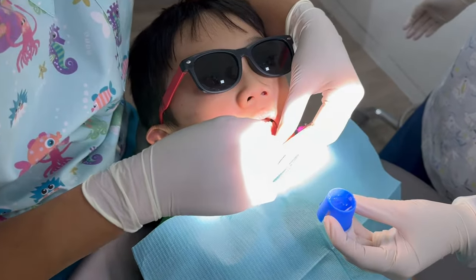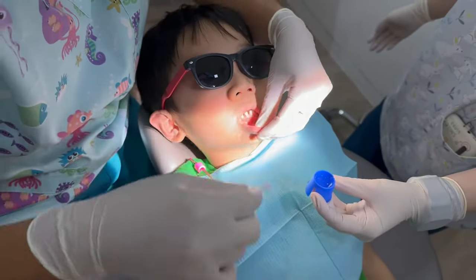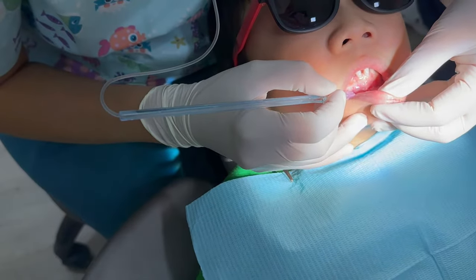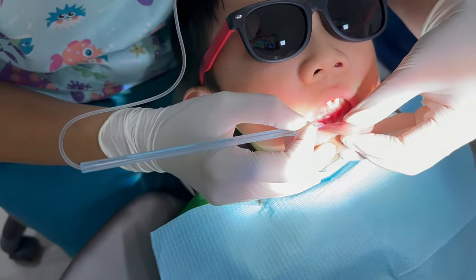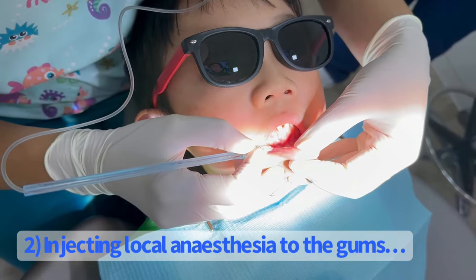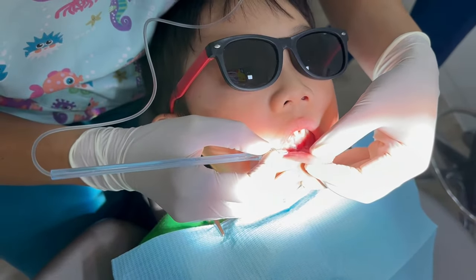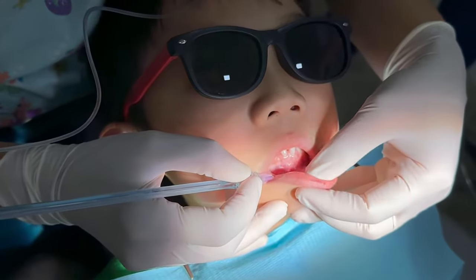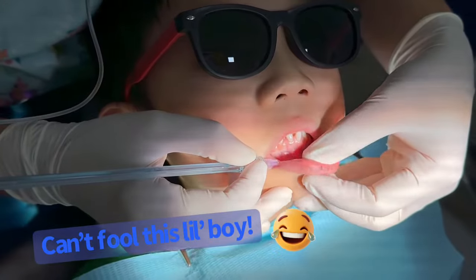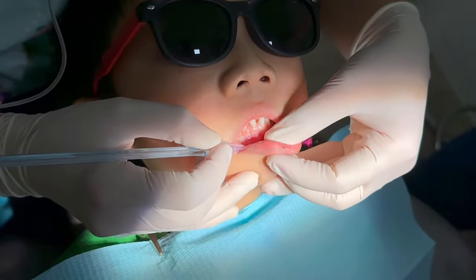I'm going to just numb your teeth so that you don't feel anything. We breathe. We massage like that. Is it painful? A bit? I'm just pressing on your leg like this, okay? Oh, what's that? This is an injection. This injection looks so special — looks like a pen. Is it painful? Just a bit.